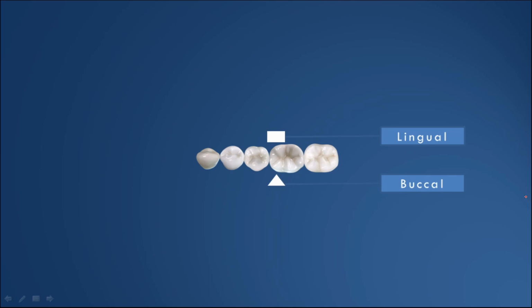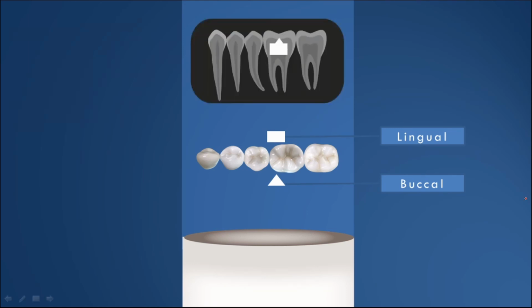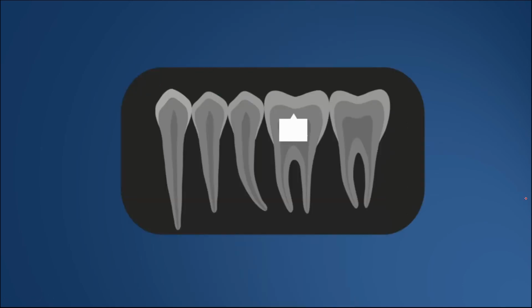Now we make a radiograph, and of course both the objects get overlapped and it will be recorded in the radiograph. But this is the radiograph that we are going to get in our hand after developing, or the radiograph that will be displayed by an RVG. If someone is showing such a radiograph with such overlapped objects, it will be impossible to differentiate which object is in the buccal and which object is in the lingual. It is literally impossible. So what to do now?